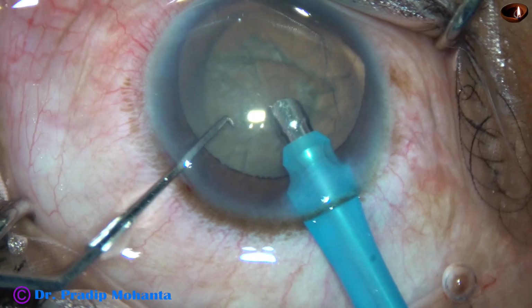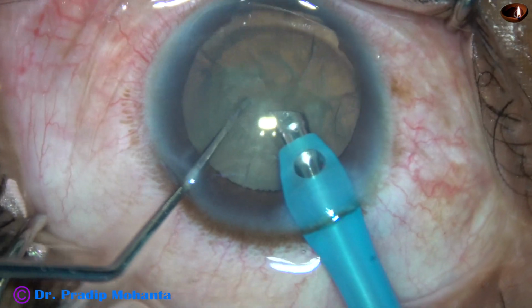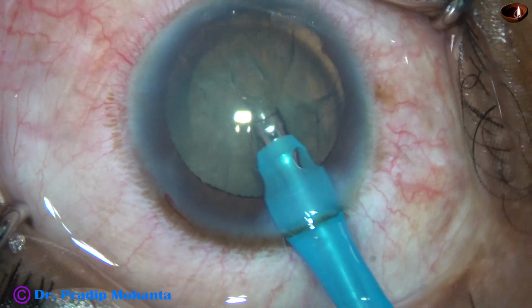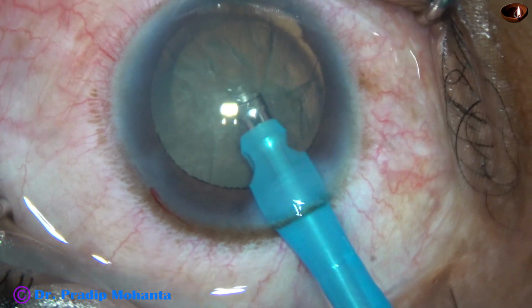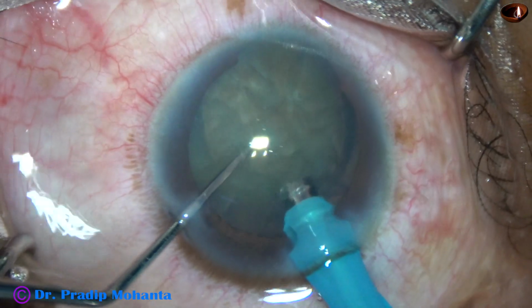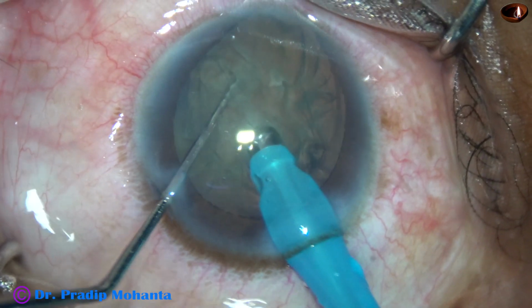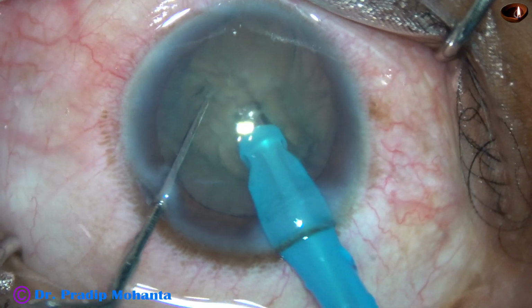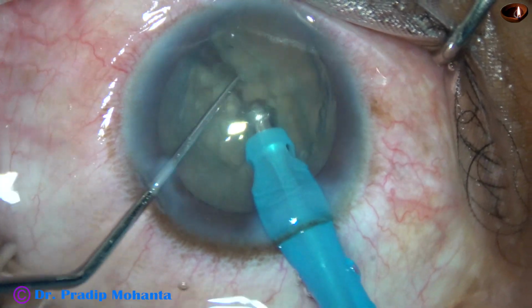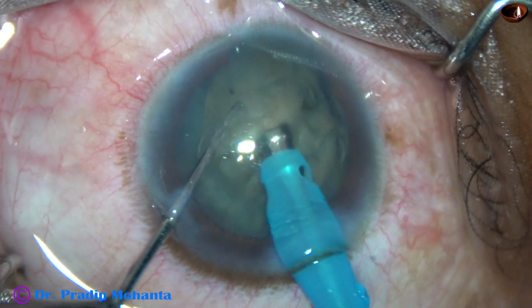Vacuum was set at 450, and I find that the cortex is quite sticky, and there is zonular dehiscence at 6 o'clock, so I don't aspirate any cortex in this case. Just want to do direct chop in the submarine technique. Bury the teeth, go through the substance of the nucleus for a distance, and chop. Rotate the nucleus and chop it here.